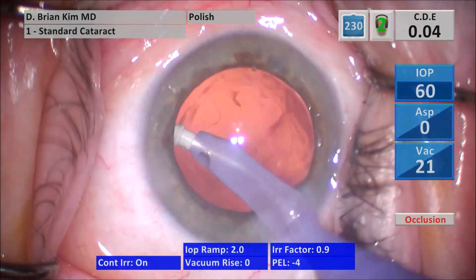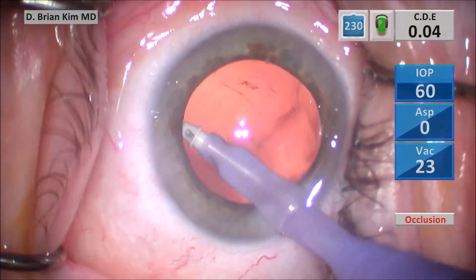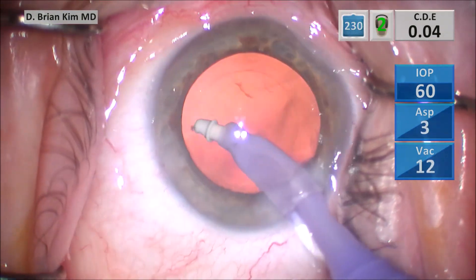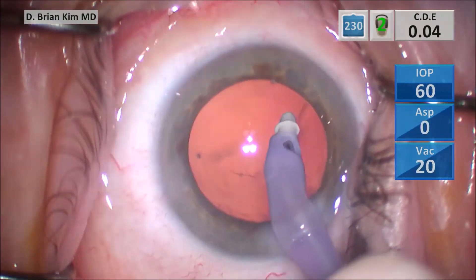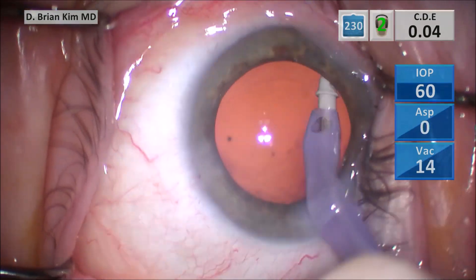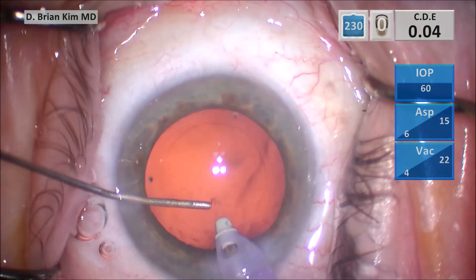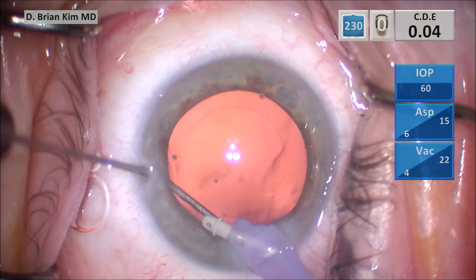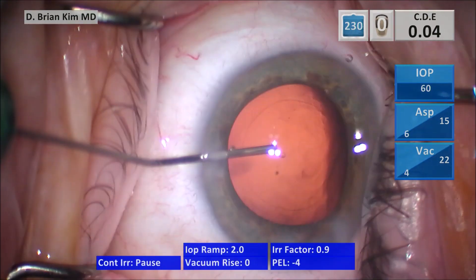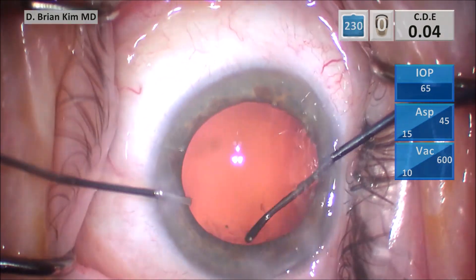I switch to the polish mode to remove all of the lens epithelial cells underneath the rexus edge, because I'm fairly confident I got all the cortical material out. Once I polish underneath the rexus, I start polishing the posterior capsule — you saw those little fine wisps that were adherent to the posterior capsule. Once it's nice and clean, I'm going to use a cannula to pulse underneath the sub-incisional capsule or fornix to make sure there are no pieces of cortical material hidden from me. In this case, it's pretty clean. Then I inject some cohesive viscoelastic to fill the bag and the chamber.